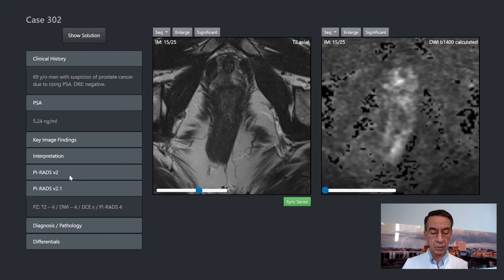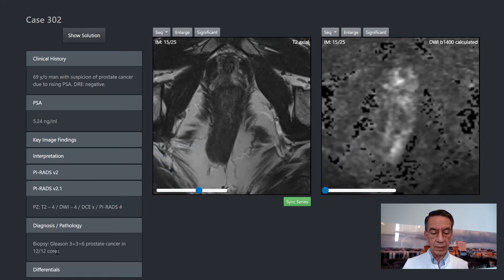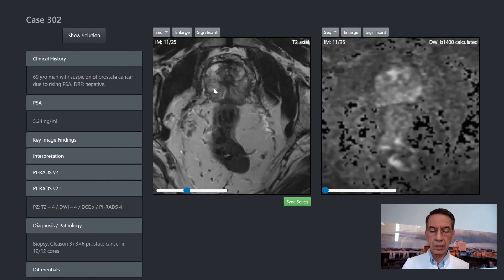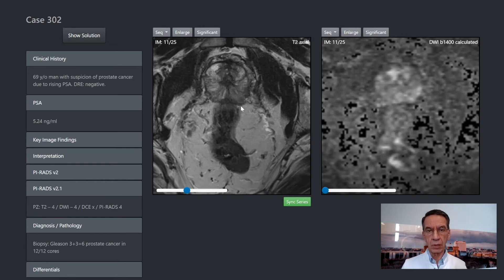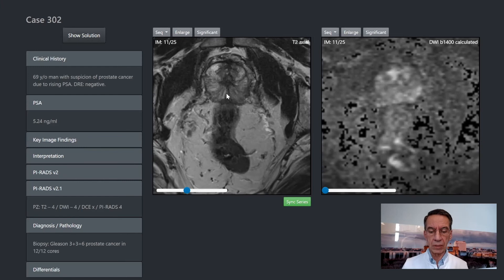Now let's have a look at the histologic result — very surprising. This patient had Gleason 3 plus 3 in all 12 needle biopsies all over the prostate. All these areas contain prostate cancer, low-grade Gleason 3 plus 3, which indicates that we will miss low-grade prostate cancers. However, it is significant here because it's everywhere in both sides. But if we don't detect a small low-grade prostate cancer, this is not a real problem — we should be able to detect the clinically significant prostate cancer.